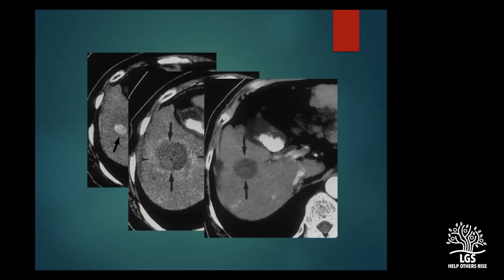And again, if the tumor is lying right next to the portal vein, or right next to the hepatic vein or cava, RFA is usually not very effective because of the heat sink effect. The heat sink effect is not great with microwave ablation. That is the reason why microwave ablation is preferred if the tumor is marginal. If it is around 5 centimeters and the patient doesn't want chemotherapy, then we can definitely offer microwave ablation in such cases. Even if the tumor is lying right next to a vessel, it's not a problem.